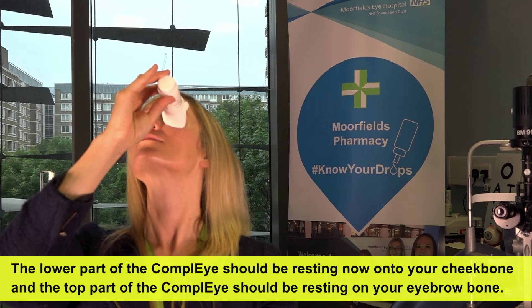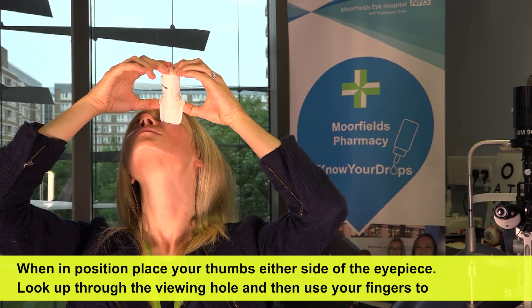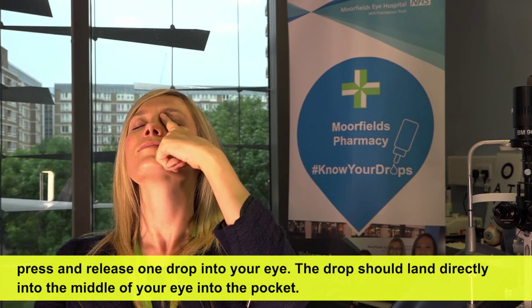The lower part of the ComplEye should be resting on your cheekbone and the top part of the ComplEye should be resting on your eyebrow bone. When in position, place your thumbs either side of the eyepiece. Look up through the viewing hole and then use your fingers to press and release one drop into your eye. The drop should land directly into the middle of your eye into the pocket.